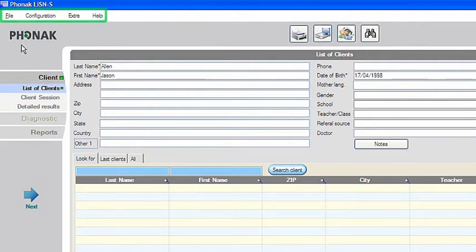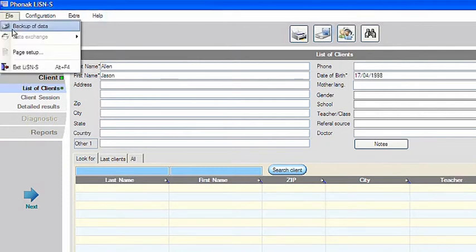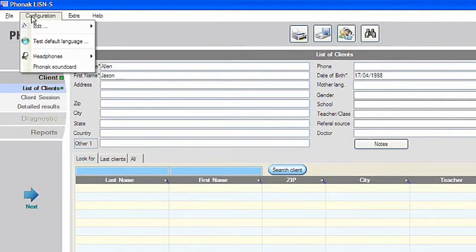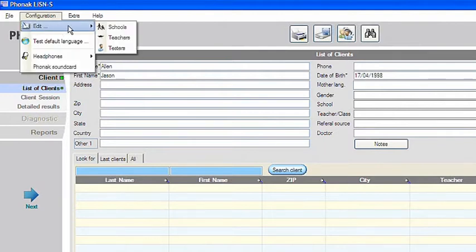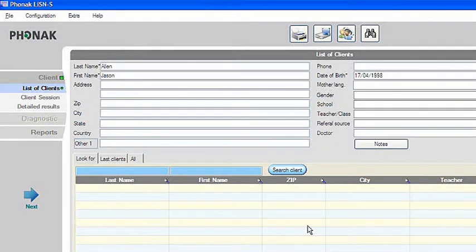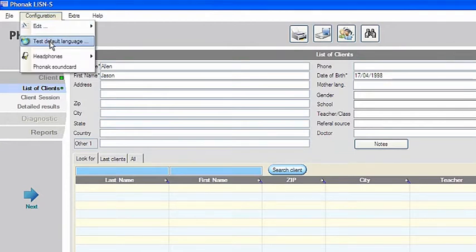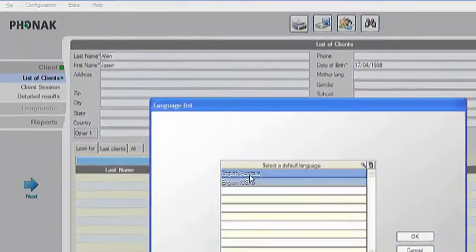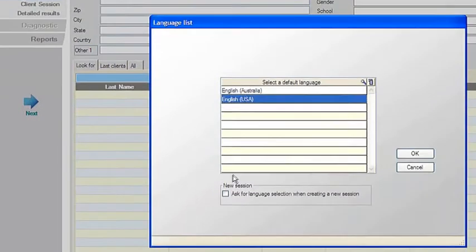In the top menu bar you will see several options. You can back up all your data, add the names of different professionals who will perform the Listen S test in your clinic, and you can of course find help on various topics. Most importantly, you must select the test language here. This setting is found in the configuration section. You can always change the test language later if you need to.